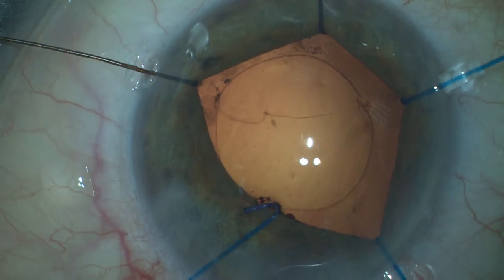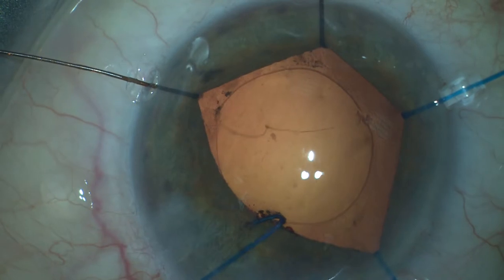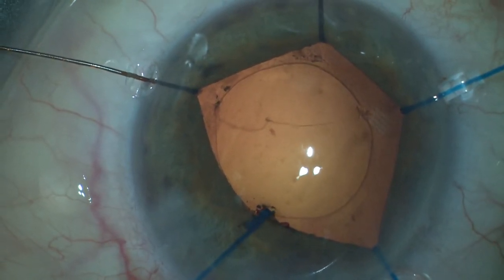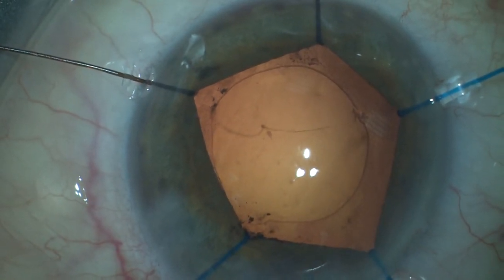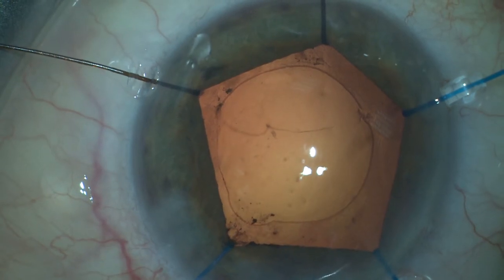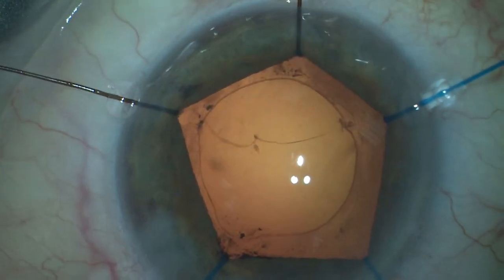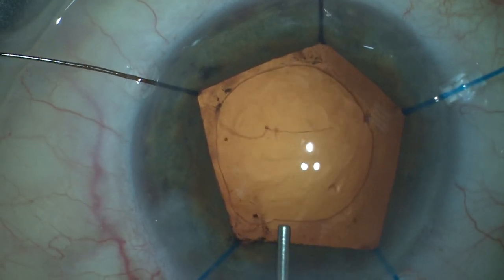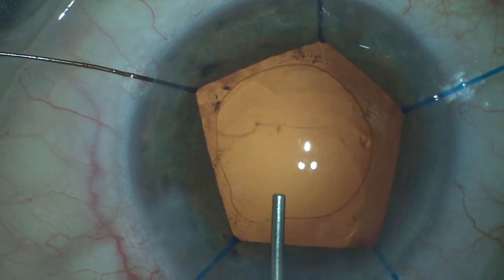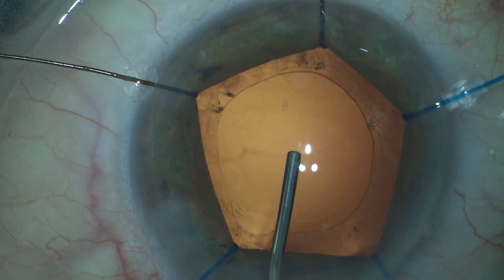Now we release the capsular bag in order to implant the intraocular lens. You can notice that this eye is a sick eye with large vessels around the limbus and a small hemorrhage at 10 o'clock, and a lot of pigment dispersion during the procedure. We fill the capsule bag with Healon.